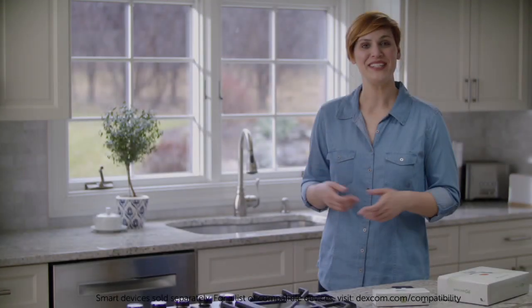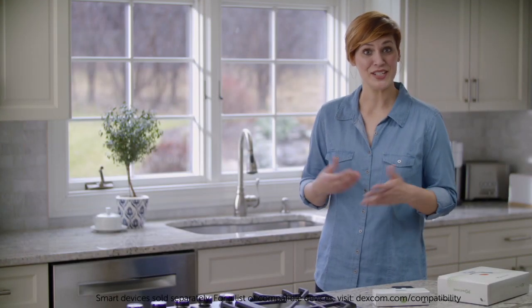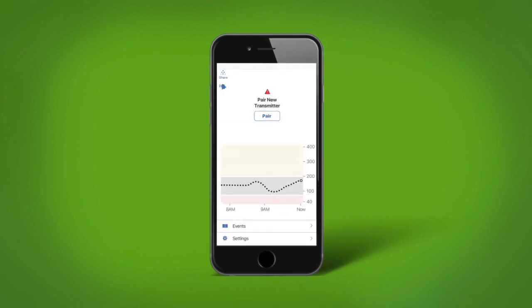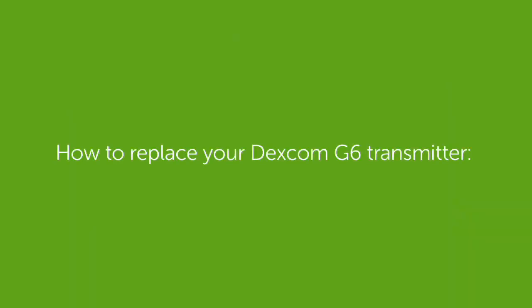I've been wearing my Dexcom G6 for about 3 months now and just got a notification to replace my sensor and transmitter. In this video, I'm going to show you how to replace your transmitter.